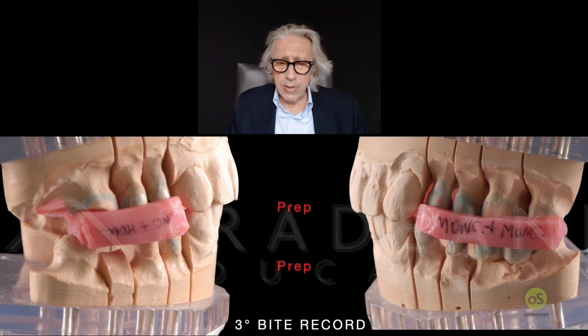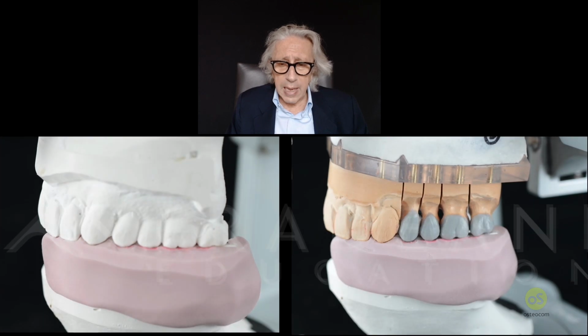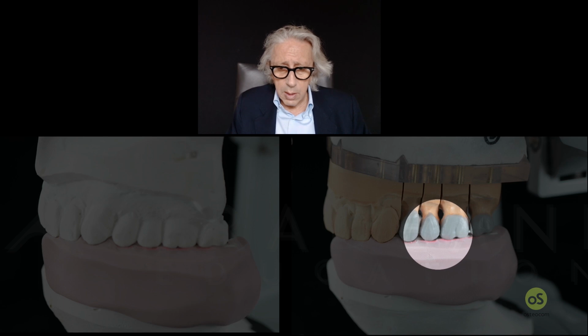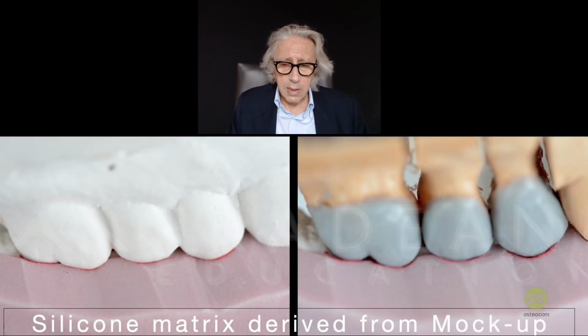And this way, we have the chance to finalize the case following, again, all the occlusal setup in terms of position of the posterior teeth that we had before. That was with the mock-up in this case, that we have tested very well in the patient's mouth, and we copy on the final one. Not exceeding in any place, just staying there, the same position, as you can see. The silicone matrix is derived, of course, from the mock-up.